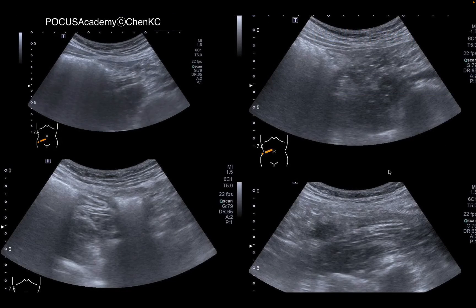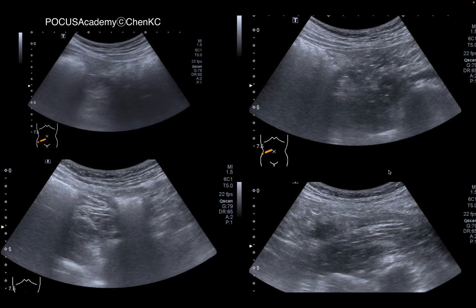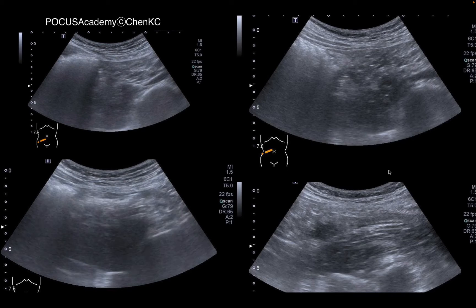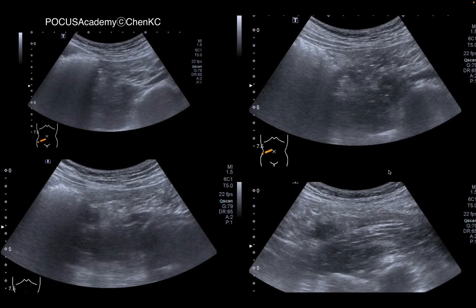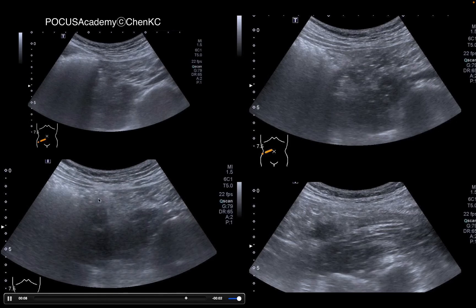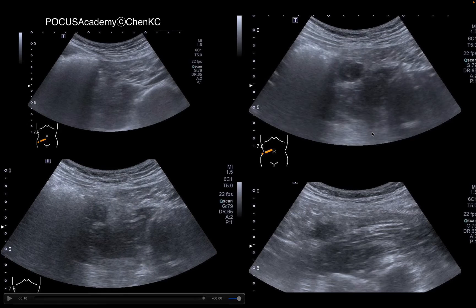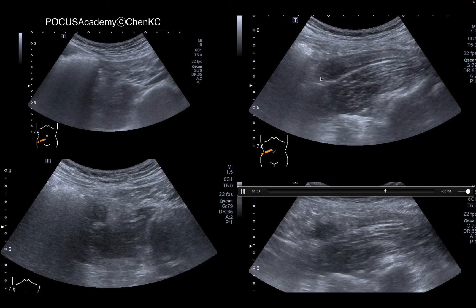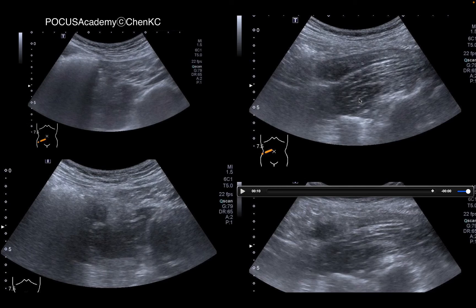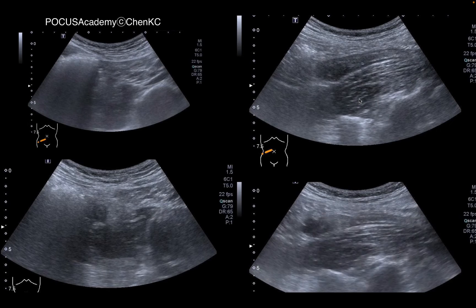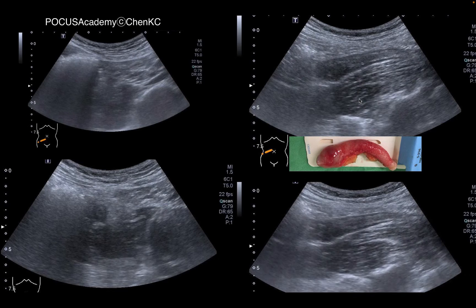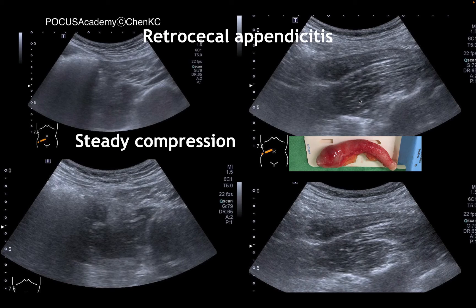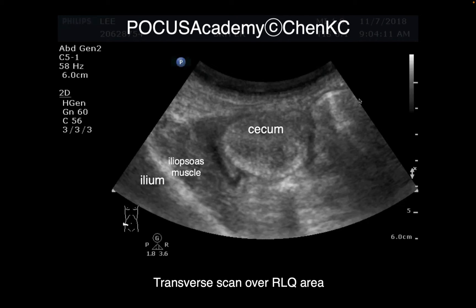Adequate compression and maneuver is quite important. This patient having right lower abdominal pain — when we scan without pressure, we observe nothing abnormal. But when we apply some pressure, we see some abnormality. Then using steady compression and rotating our transducer, we see this retrocecal appendix distended and swollen at its tip. The appendix matches our sonographic findings. Applied steady compression is quite important when observing GI tract abnormality.